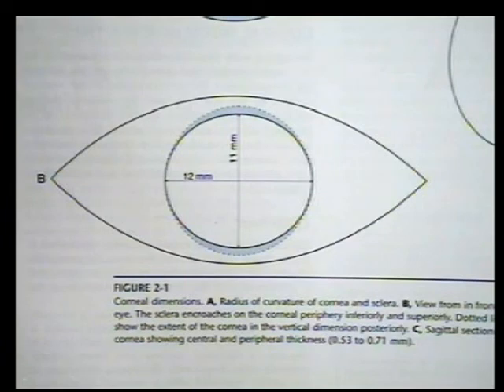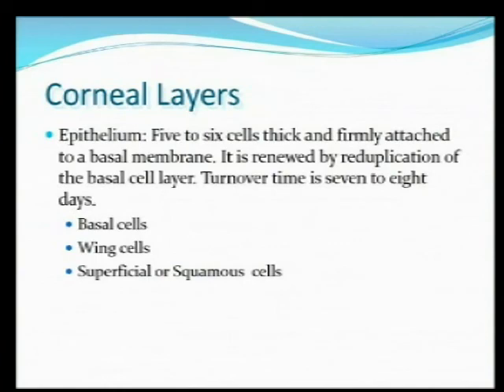The cornea is slightly oval in shape, so another reason why we use the horizontal visible iris diameter is we want to have the longest dimension when we're selecting a contact lens. We'll see when we get into soft lenses, the rule of thumb is you get that HVID measurement, you add 2 millimeters, and that tells you the smallest soft lens that you should fit to somebody. Because the cornea is so important, we need to have a good understanding of the different layers of the cornea.